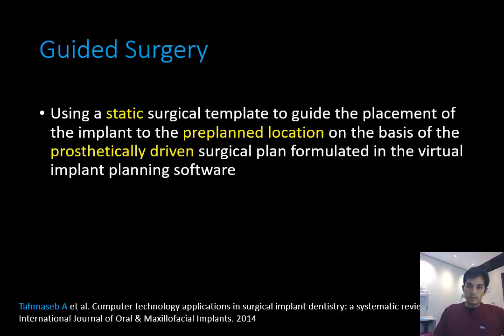So having planned our case and hoping to do a couple of immediate implants for this patient after extraction, we now go into fabrication or design of our surgical guides. Now, just before I go into the steps involved in designing a guide, just want to establish what we mean when we talk about guided surgery.